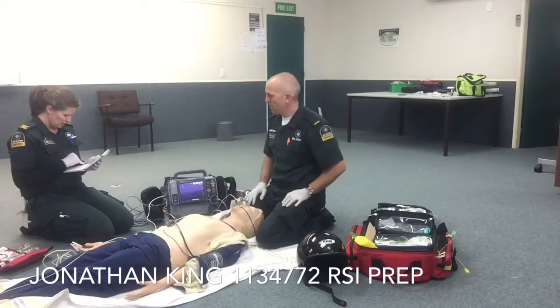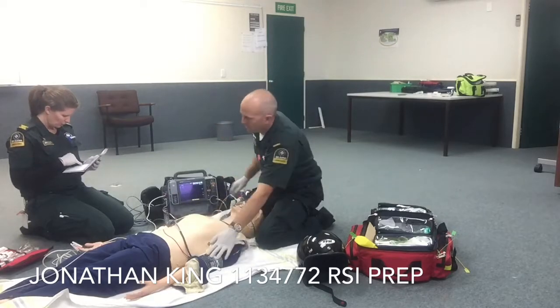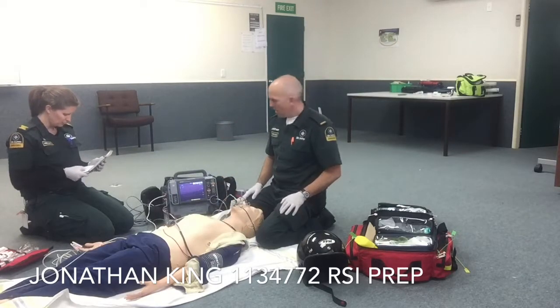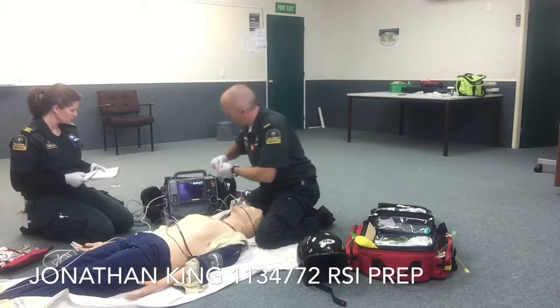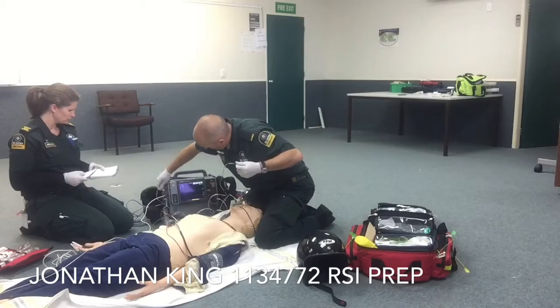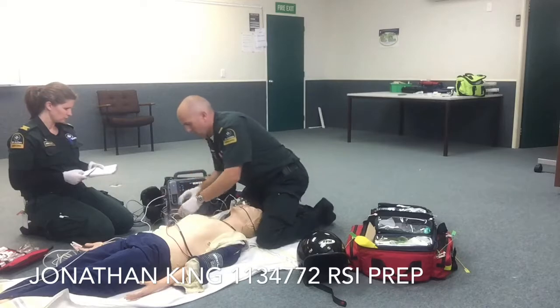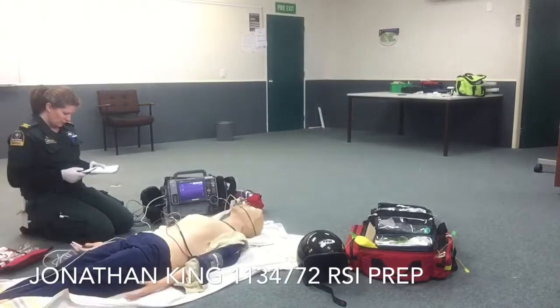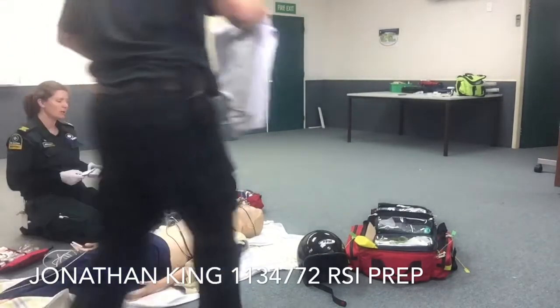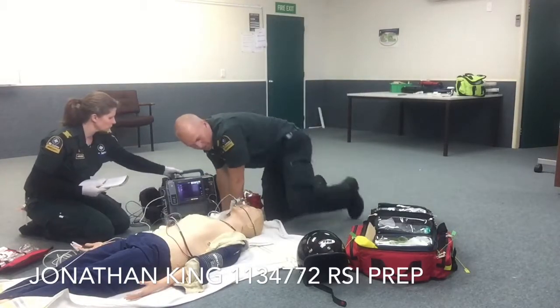Okay. Attach ECG, NIBP and SpO2, which we've done. Check. Prepare capnography if this is available. Prepped. Calibrated. Alright, that's calibrating. Position the monitor so that it can be seen, leaving space to the right side of the patient's head for intubation equipment. Yep. So we have space there, we have a towel to place our equipment.